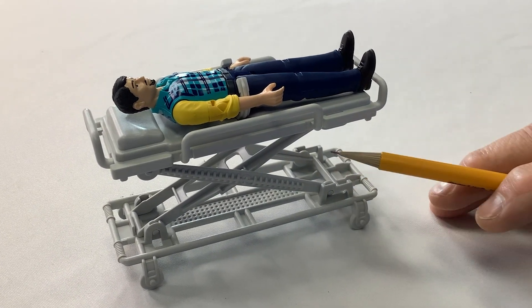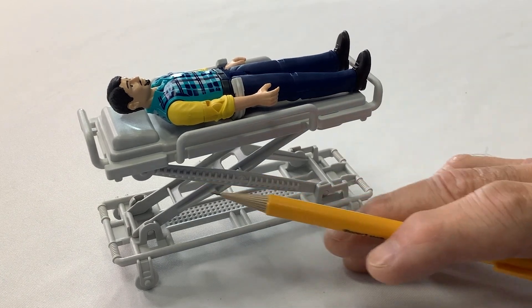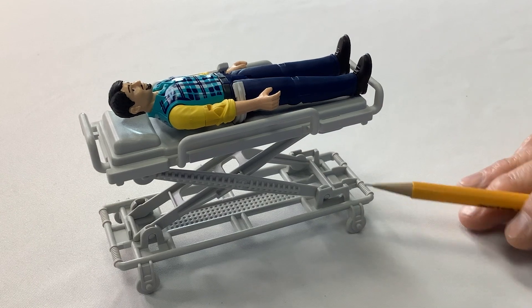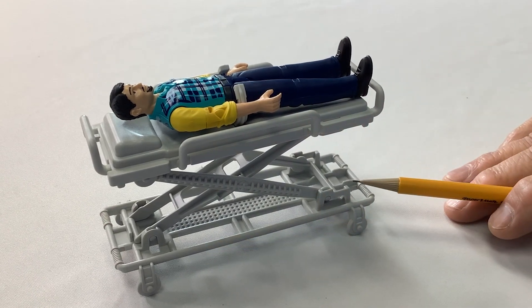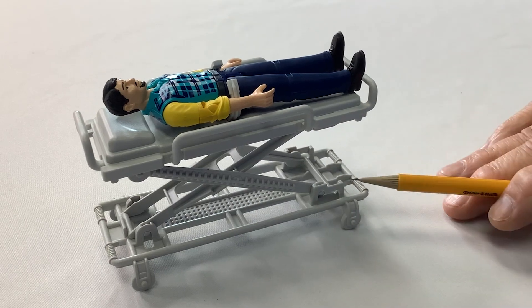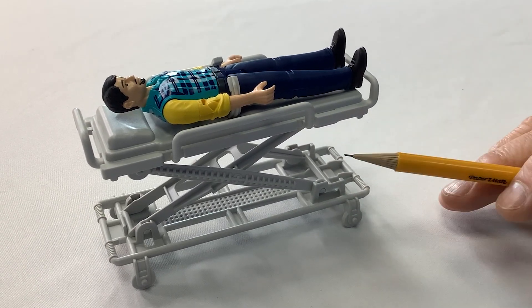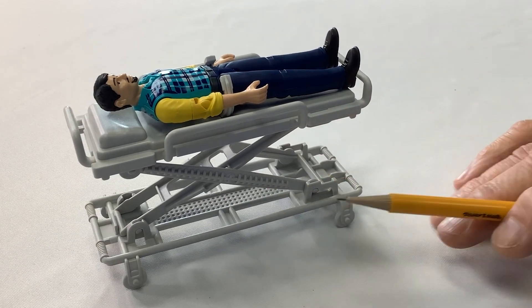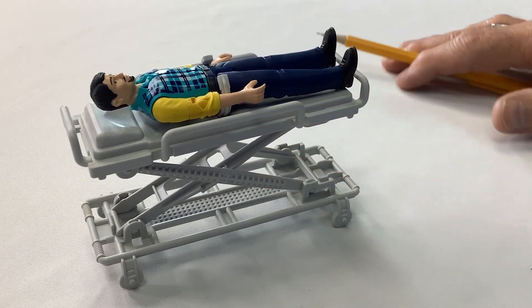The load cells generally are placed underneath the patient area because it gives you the most resolution. You can place them down in the feet — it weighs the entire scissor lift — but you lose some of the accuracy of taring off the weight of all of the stretcher components. So the best place is underneath the patient itself.